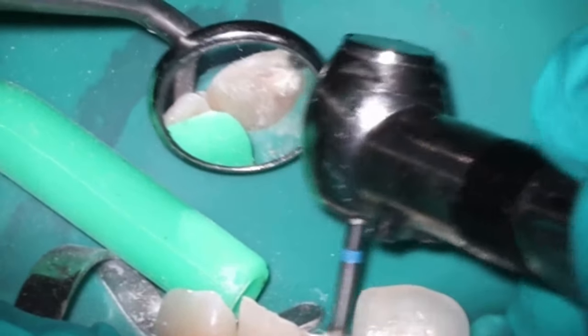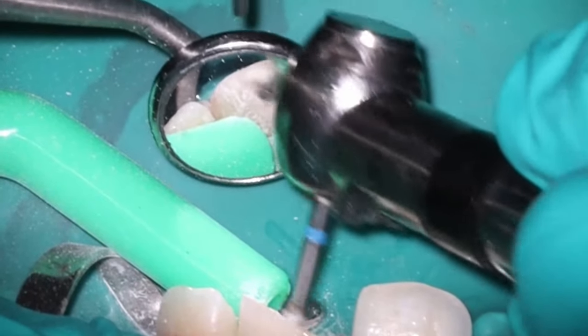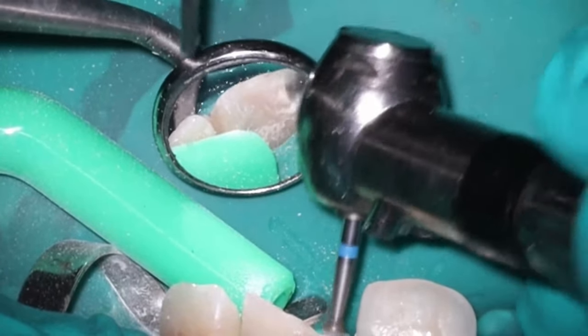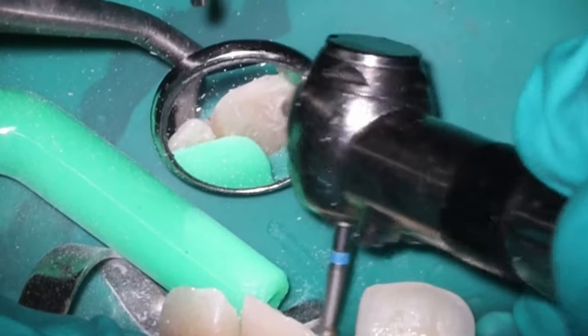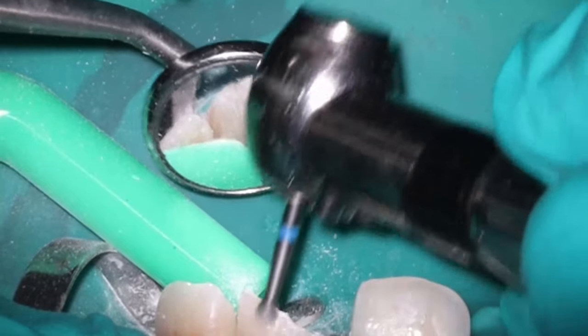So I'm going to do something with bioceramic material instead, a little more modern as far as the filling material here. You'll notice I'm not using water. I'm not really putting a lot of pressure on the tooth. I'm not worried about it heating up here. Mostly what I'm doing is just removing the composite, and having it dry allows me to see that a little bit better.